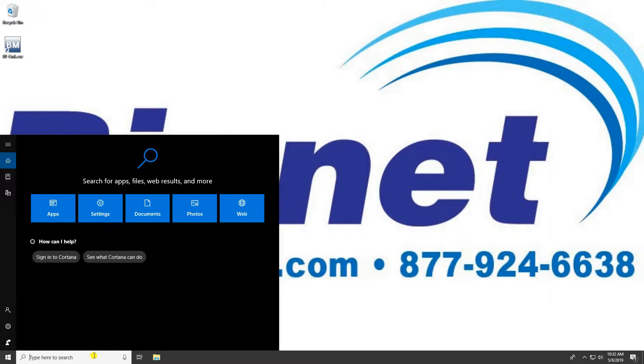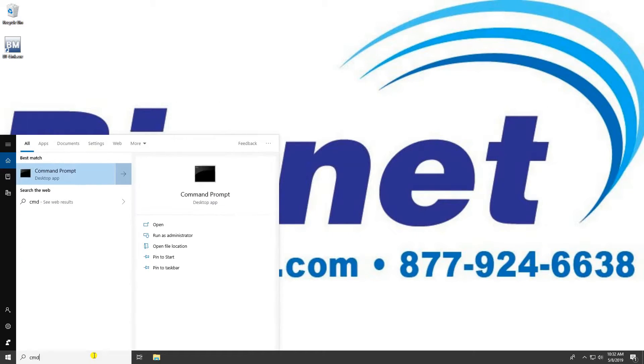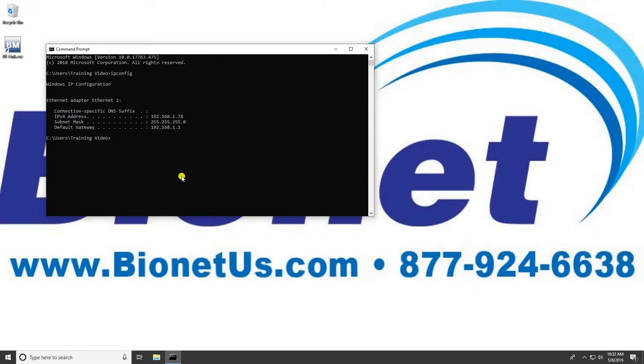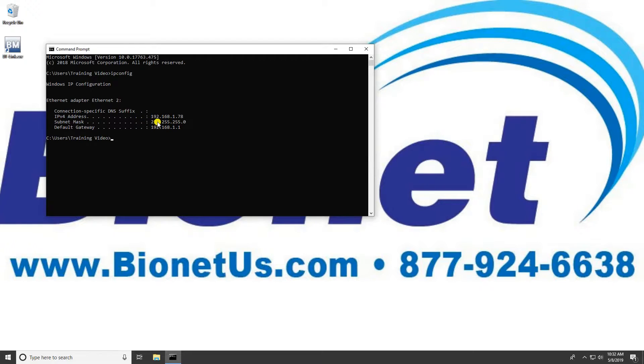type CMD in the search bar or Cortana. This will bring up a link to the command prompt. Click this link and type in IPConfig as you see it on the screen. The IPv4 address shown below is the IP address for this computer.